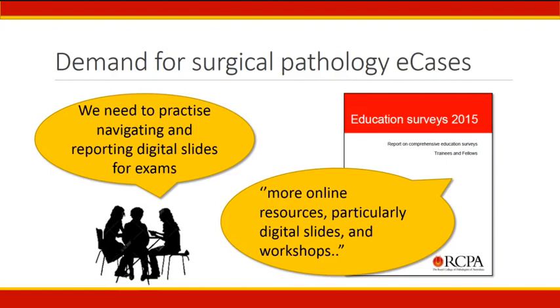So I know you can find anything on the internet, including online virtual microscopy slide repositories, as demonstrated by Dr. Eric Glassy in the digital pathology workshop yesterday. These often are indexed by diagnosis only, which is fine if you are searching for a particular diagnosis, but many cases don't have any clinical information, such as age, gender, or site, so you can't use this collection to test yourself.